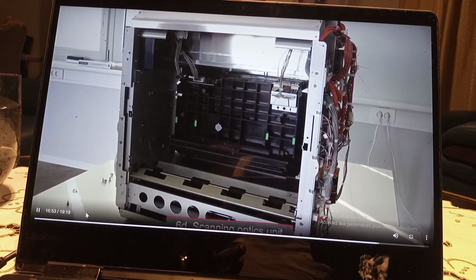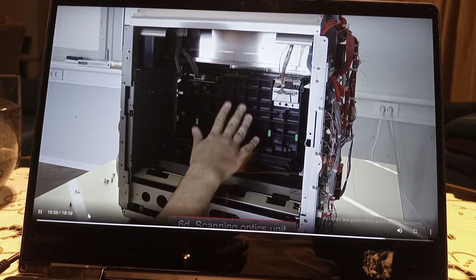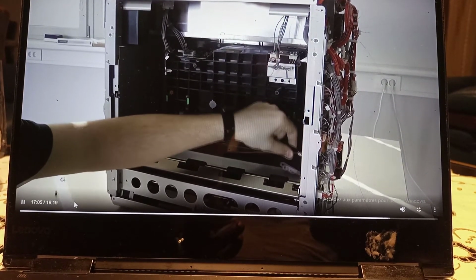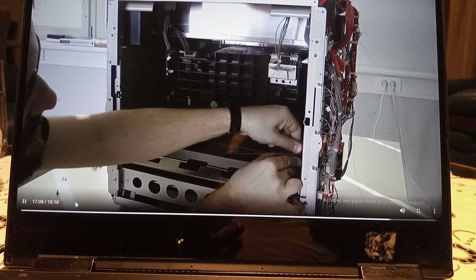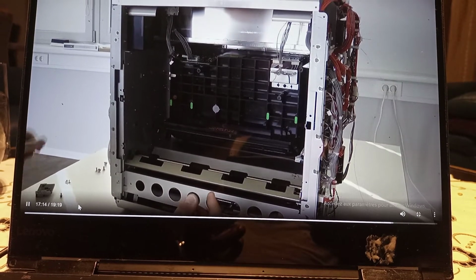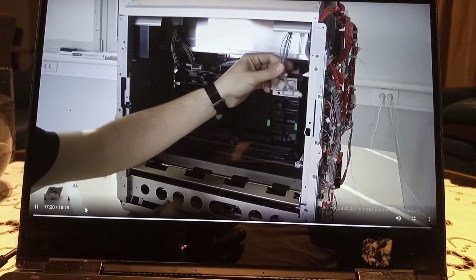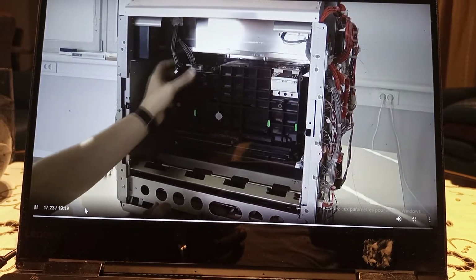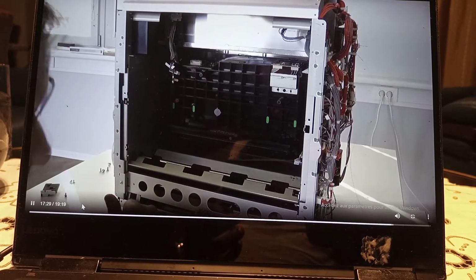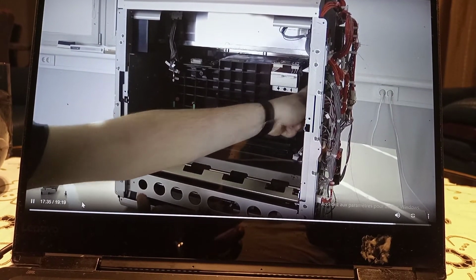Okay, the next step is to remove the scanning optics unit. It's a complete unit in this black box here. To get it removed, first of all, you have to loosen 1 screw here to remove the image plate start sensor. Just disconnect the small cable and remove the board. After that, disconnect the 3 connections, 2 of them in the right corner and 1 of them in the left corner. You have to loosen 4 screws, but don't unscrew them, just loosen them. There are 2 on each side.